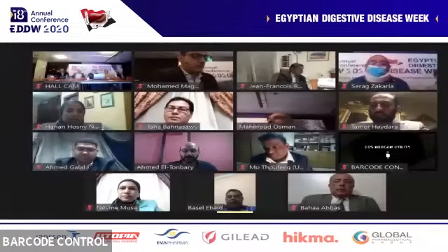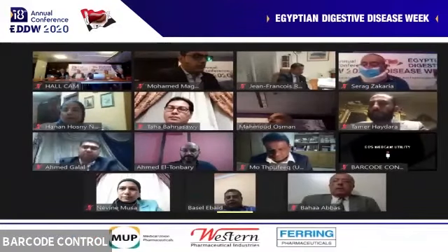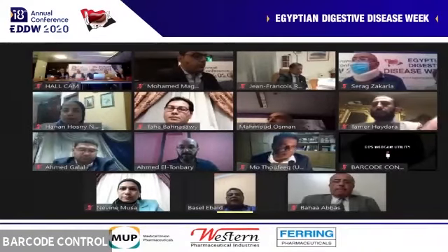Thank you very much, Professor Ahmed, for this very nice presentation. I just wanted to ask you, how do you estimate the size of the polyp and the pedicles?